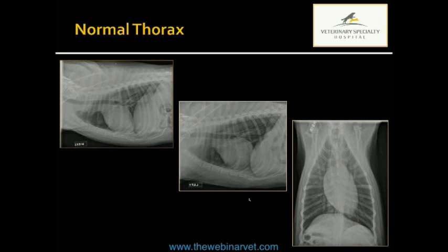And then moving on to the thoracic cavity, the sequence that I usually take is I'll start with the pleural space, looking for evidence of fissure lines or retraction. Once I've completed that, and we'll go through these in more detail with each, we'll review the actual pathological diseases that lead to respiratory distress.